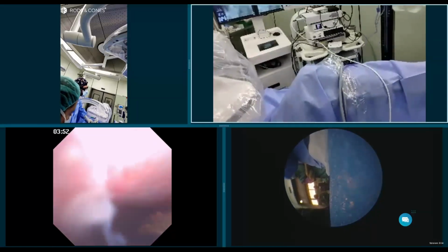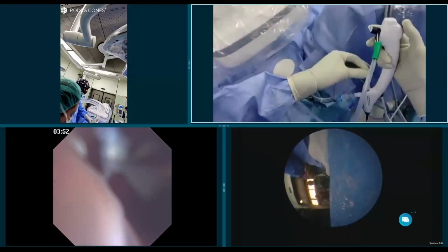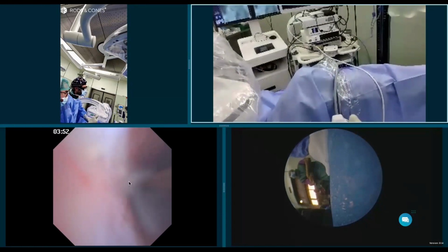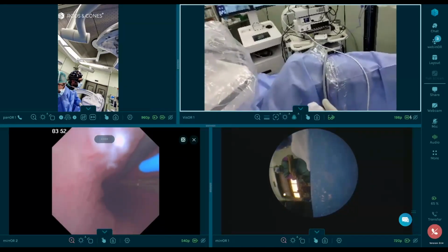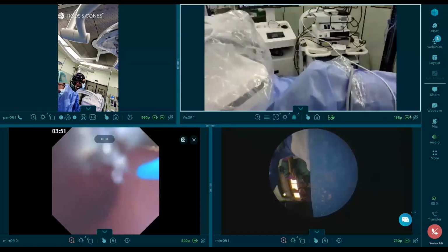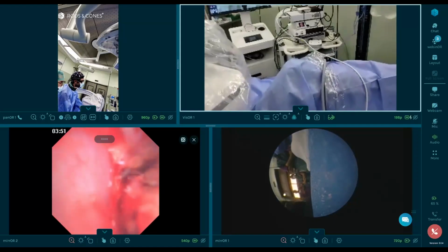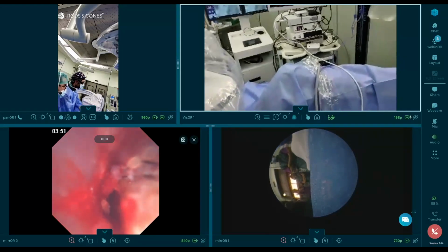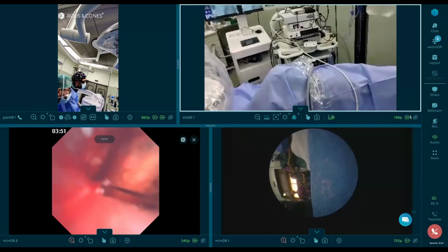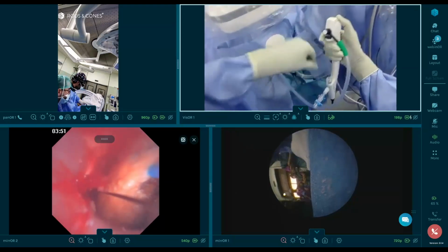Remember that the aspiration is on, but we have the working channel in use with the irrigation. Excellent. So we have there. Lo podemos poner en listo, por favor. So the idea now is to pump. Okay. We got very close to the stone. Abre, por favor. My resident is opening it up. And then I just go close to the stone. Gracias.